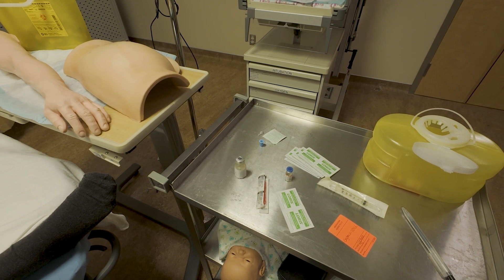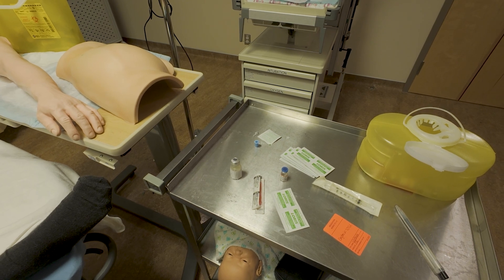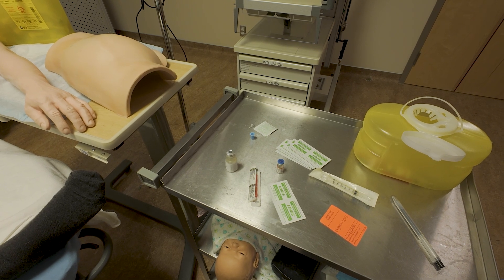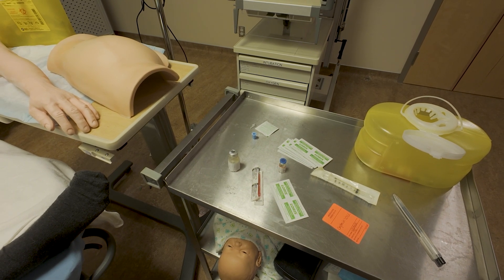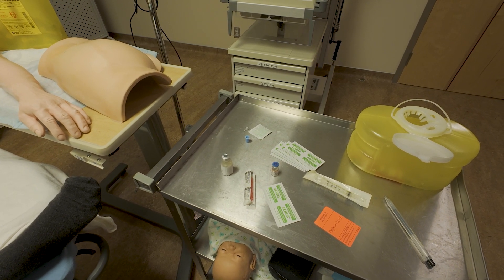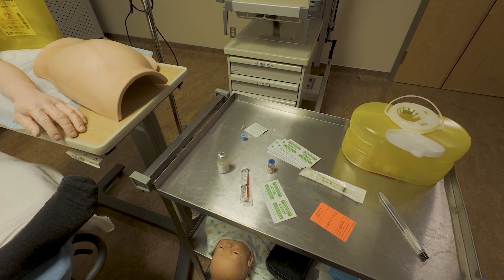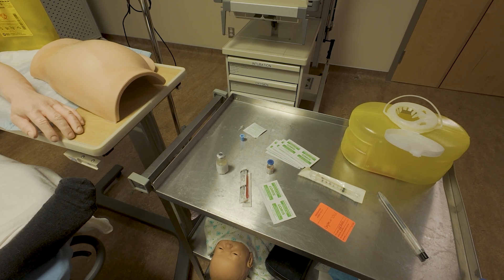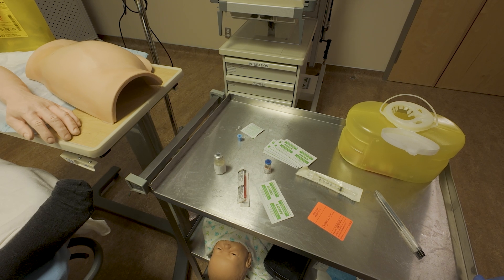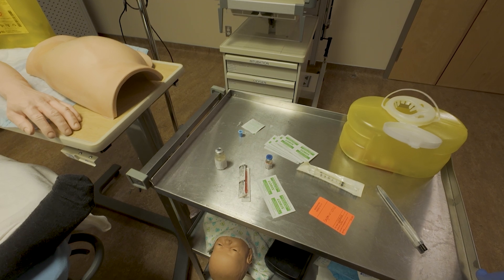I'm going to illustrate two other sites other than the thigh for medication administration. For oxytocin administration, we would typically use the anterior vastus lateralis — the thigh muscle — for intramuscular injection. Other times we might use the ventral gluteal site for the administration of WinRho or therapeutic rest medication in early labor, such as morphine and gravol. We can also sometimes use the deltoid site on the shoulder for WinRho or RhoGAM.